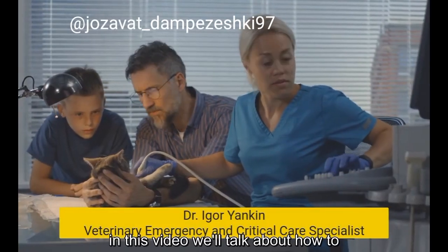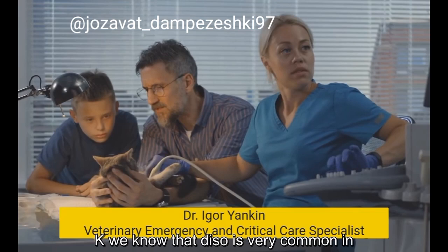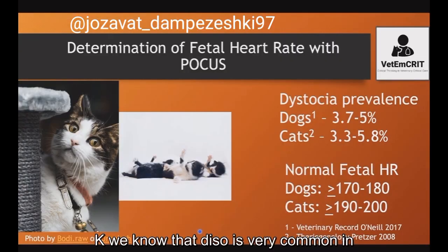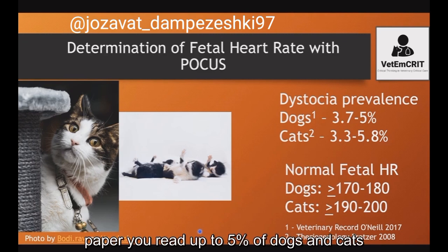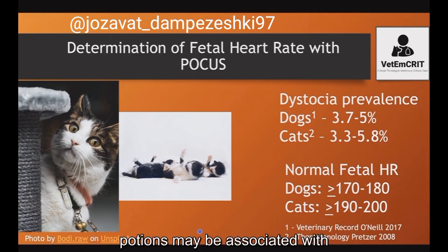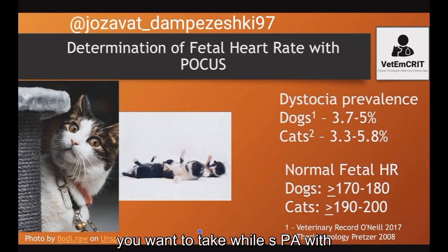In this video, we'll talk about how to obtain a fetal heart rate with point-of-care ultrasound. We know that dystocia is very common in small animal practice. Depending on the paper you read, up to 5% of dogs and cats parturitions may be associated with dystocia. One of the most important steps you want to take while assessing a patient with dystocia is to determine if fetuses are viable, and if so, what are their heart rates?